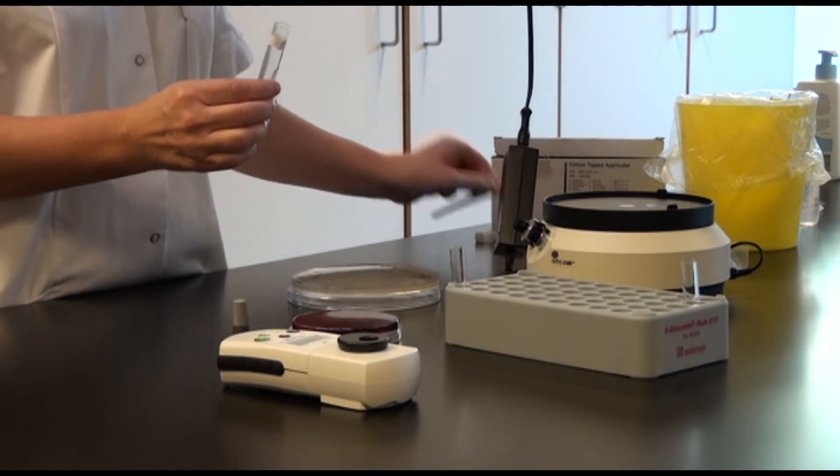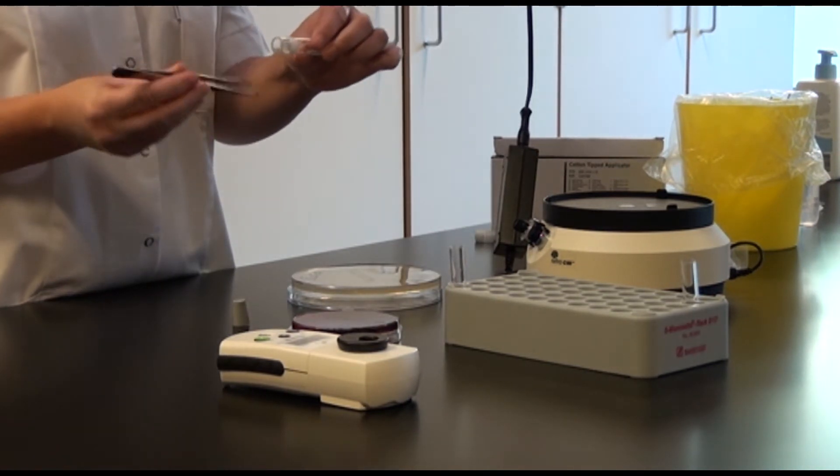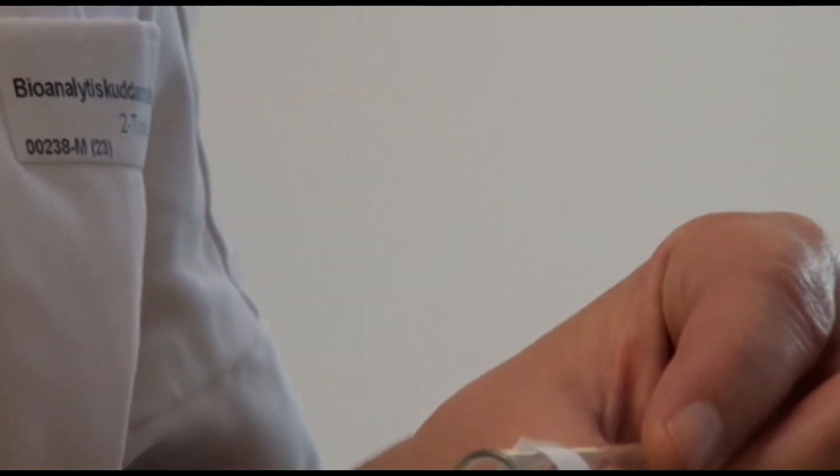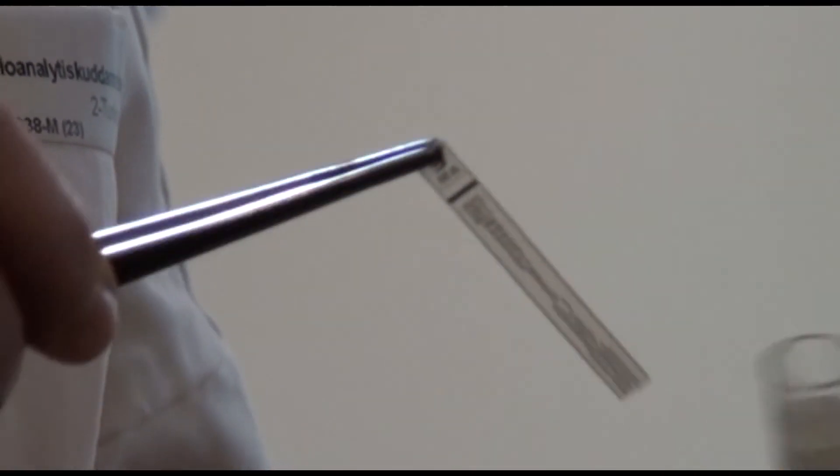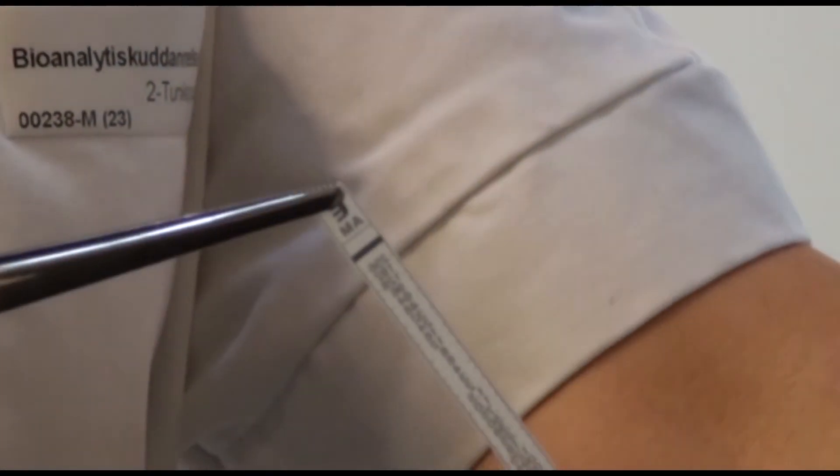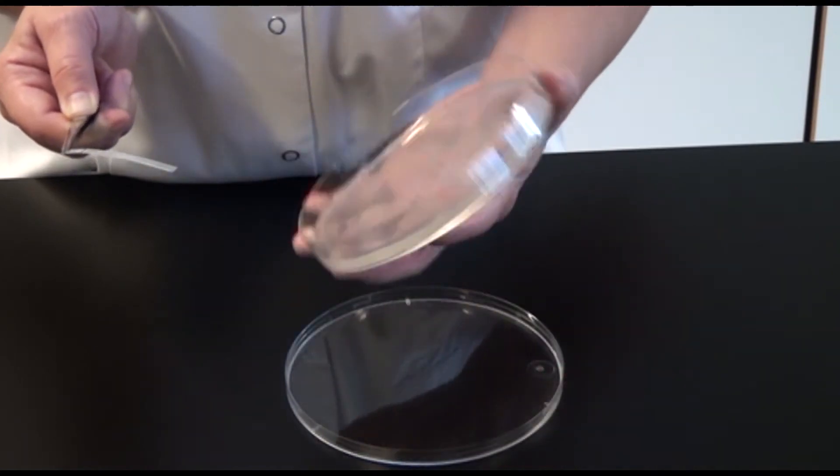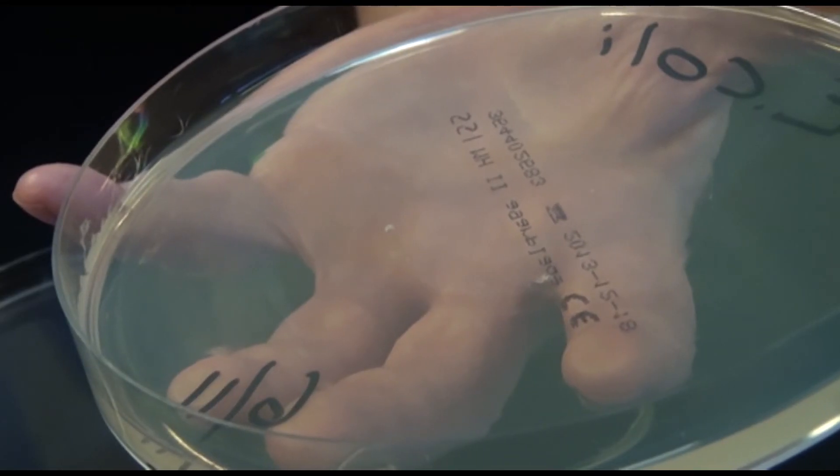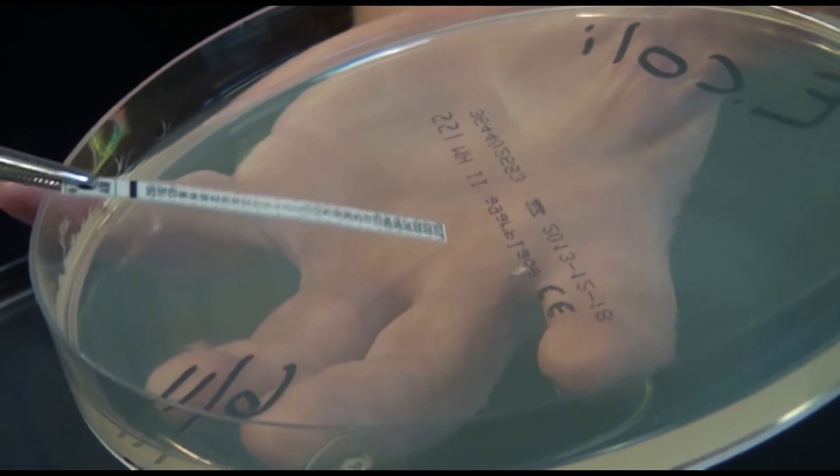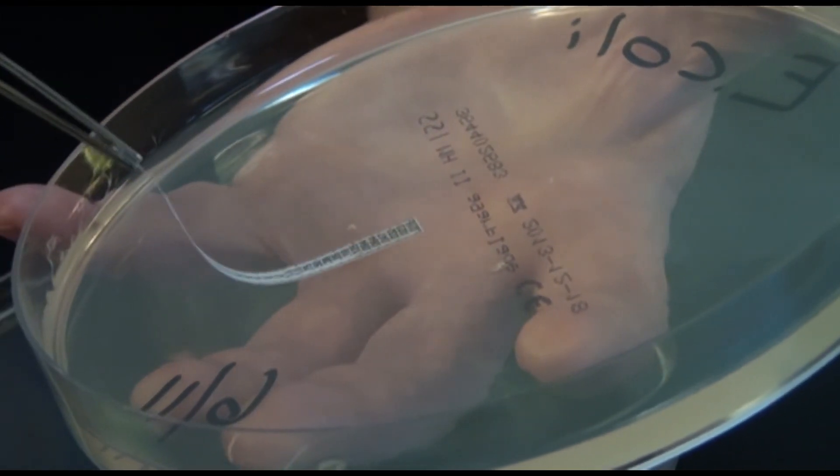An E-test is picked up with the pincet and be completely certain that you only have one. The E-test is placed on the plate with the highest concentration of antibiotics facing toward the edge, and be completely certain that there are no bubbles underneath.